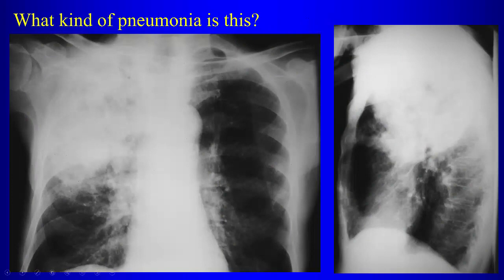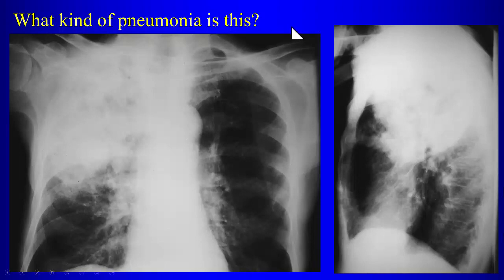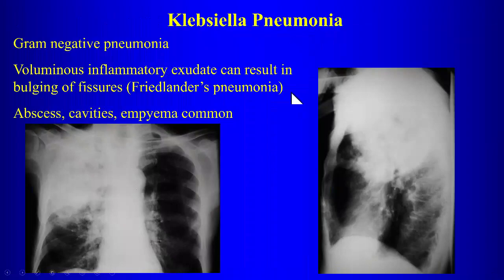If this is pneumonia, what is unusual about the appearance? There's mass effect on the major fissure here — this is called Friedlander's pneumonia. The classic organism is Klebsiella. The idea is that these organisms cause exuberant consolidation that can result in mass effect, actually enlarging the lobe. It's associated with complications: abscesses, cavities, and empyema are all common.